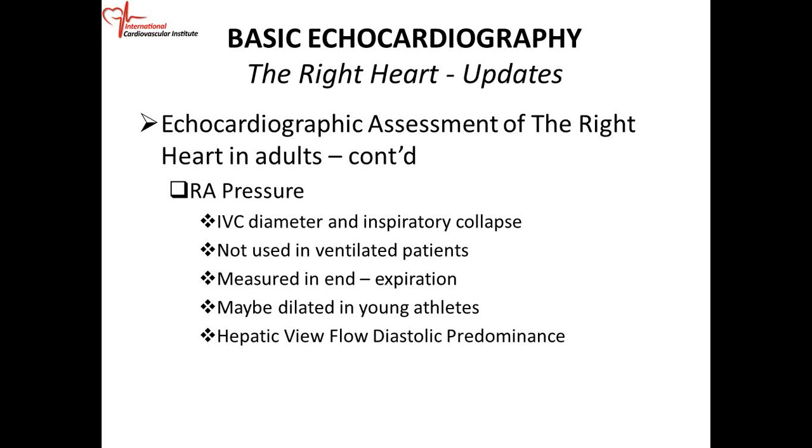However, it should not be used if the patient is on the ventilator. And when you're measuring the IVC diameter, it should be measured in end expiration. So remember, the patient is breathing in. When you breathe in, that's inspiration. When you breathe out, that's expiration. At the end of the expiration, you tell the patient to hold the breath, and you do your measurements. Another important point, the IVC might be dilated in young athletes, so bear that in mind.